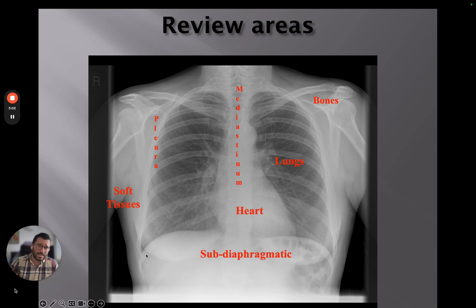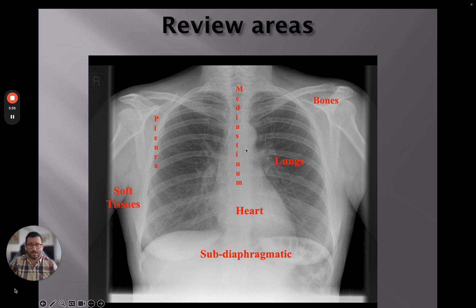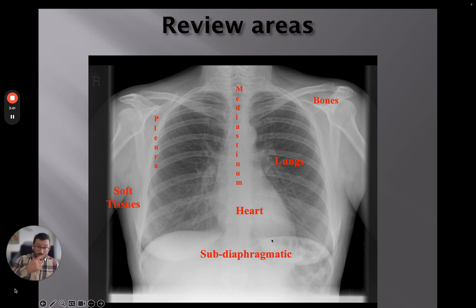I then look at the subdiaphragmatic region to assess for any free gas below the diaphragm. We can't do that on the left because we usually have a gastric bubble there, but we shouldn't have any air between the diaphragm and the liver. Once I've done that, I start again from the top, looking at soft tissues around the chest wall, then the bones, and then some of the trickier review areas — like behind the heart. Using modern PACS systems, we can invert the image so white becomes black, which can really make the area behind the heart stand out.